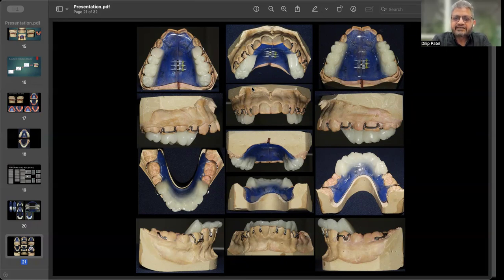It is retained interdentally by the eyelet clasp, an Adams clasp on the first premolar, and a half C clasp on the lower first molar, engaging the last molar, that holds the appliance properly and controls further flaring of the lower incisor.